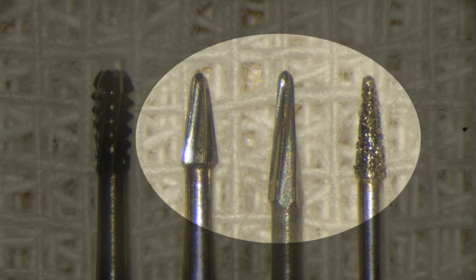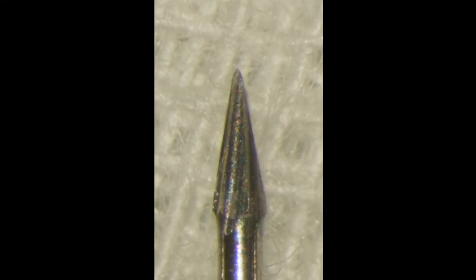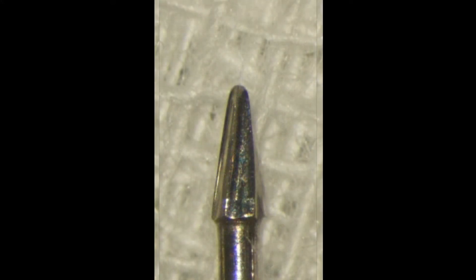These cone-shaped burrs have tips with a very small diameter and are excellent for the micro-removal of enamel. However, the tip of this burr easily wears out and its cutting efficiency quickly declines. This is inevitable due to the small size of the tip.